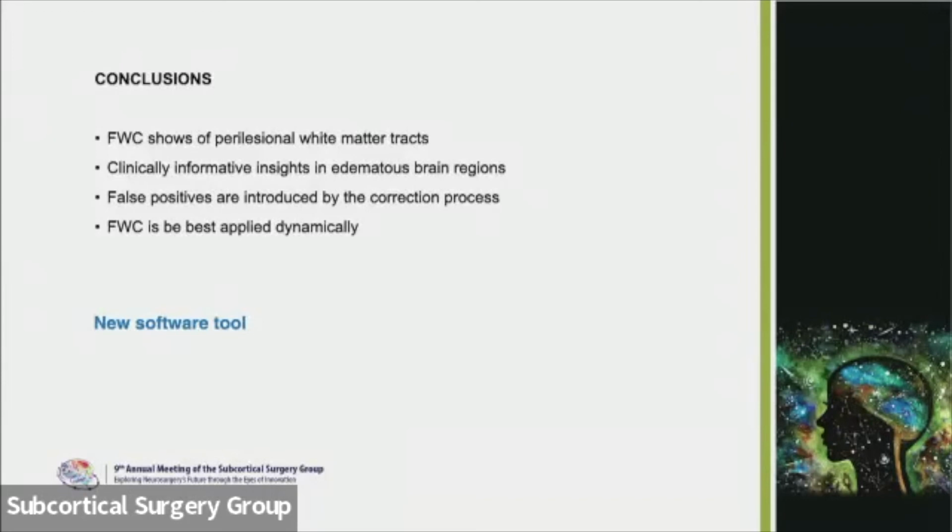Right, so in conclusion, our free water correction algorithm shows perilesional white matter tracts pretty well. It's clinically informative. It gives insights into edematous brain regions. It has false positives that are introduced by this correction process, and it is best applied dynamically by the surgeon manipulating that by hand. It's led to a new software tool, and this is just one more iteration in the path to doing more.